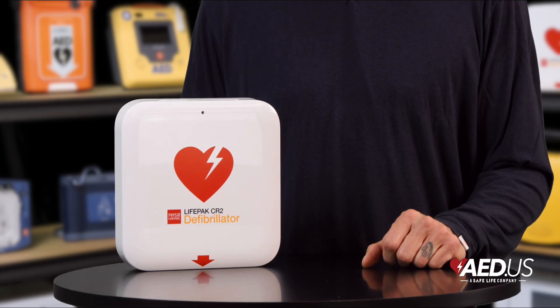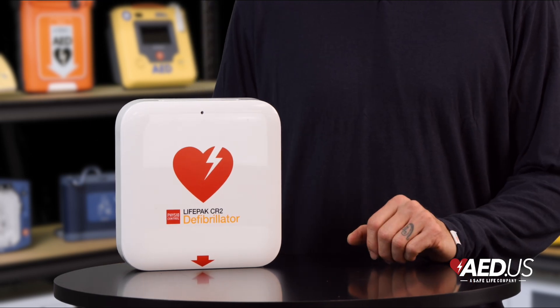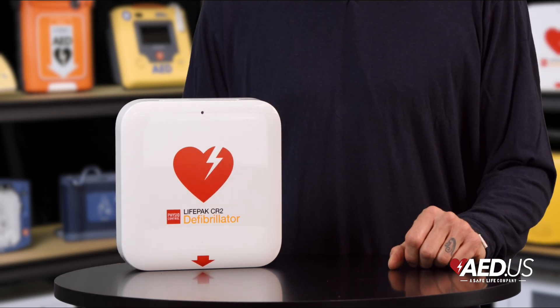Backed by an eight-year warranty, the CR2 combines durability with advanced features you can rely on. And with strong customer support and training resources, Stryker ensures you'll feel confident and be prepared when it counts.